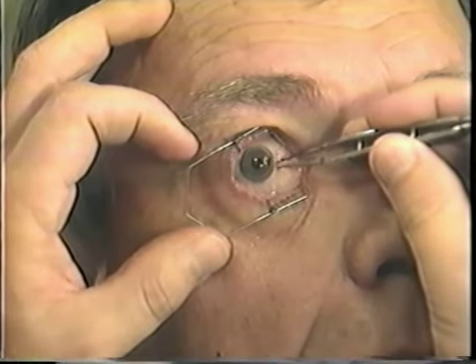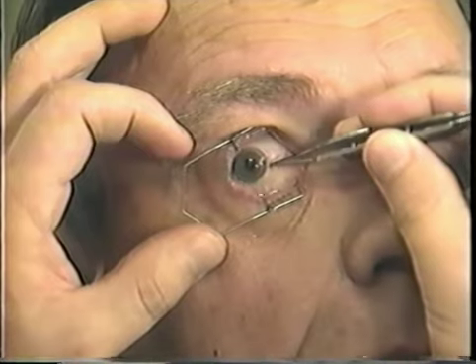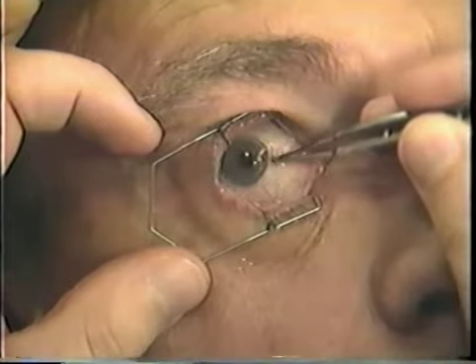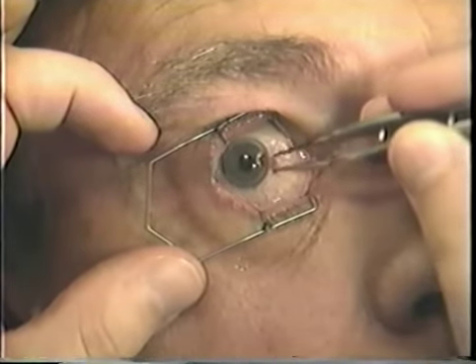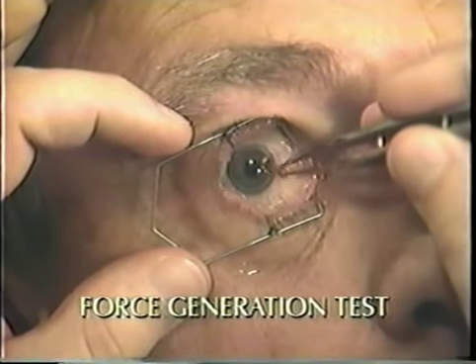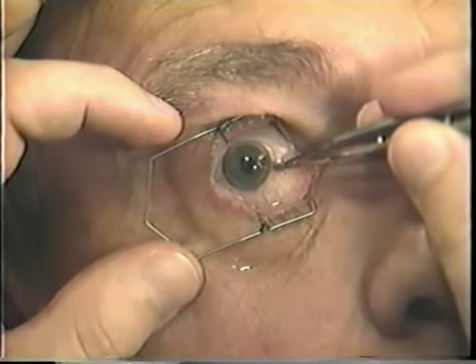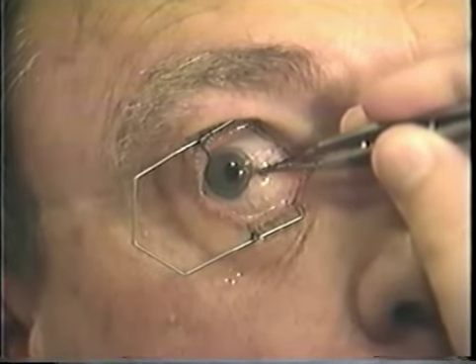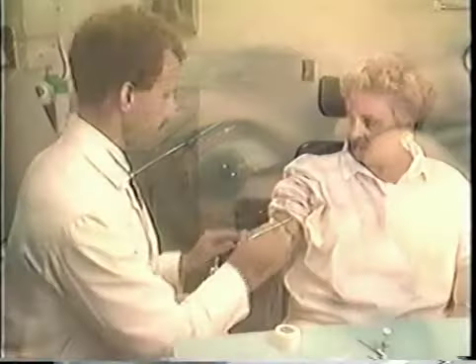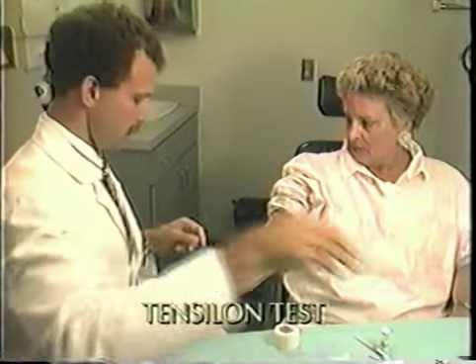If the eye can be easily moved into the field of duction limitation, a paresis is present. However, if the deviation is due to a restrictive strabismus, the eye will not move into the area of duction. This produces a positive forced duction test. To perform a force generation test, have the patient continue to look in the direction of the duction limitation. Pull in the opposite direction with the toothed forceps in order to feel the strength or weakness of the muscle's force. If myasthenia gravis is still suspected, it is prudent to perform a tensilon test.